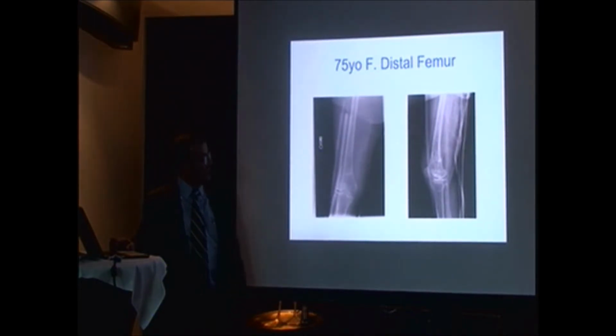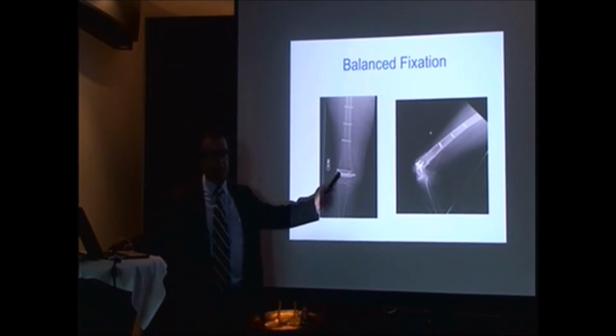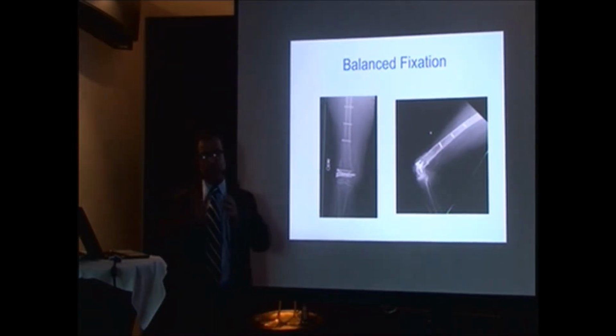Another one with a distal femur. This is the plate that came out. I have to say this plating system is quite nice. If you've ever used the Synthes LIS system, it's very, very similar to the LIS. If you're familiar with the LIS, this is going to be very familiar to you. And what's nice about this, though, is it's polyaxial. The LIS everything was convergent. With this one, I can put the screws wherever I want.